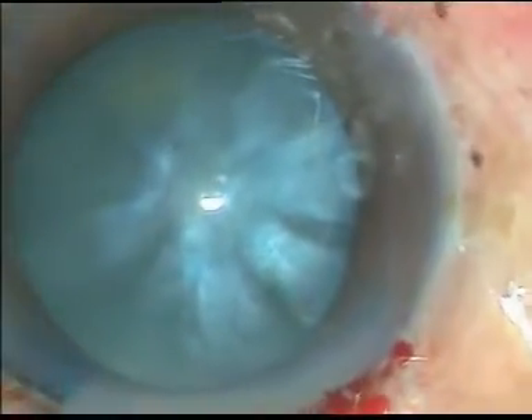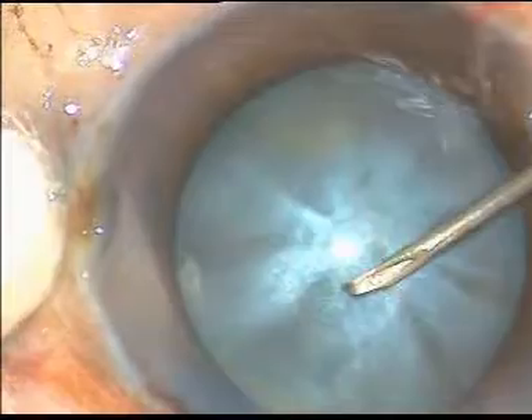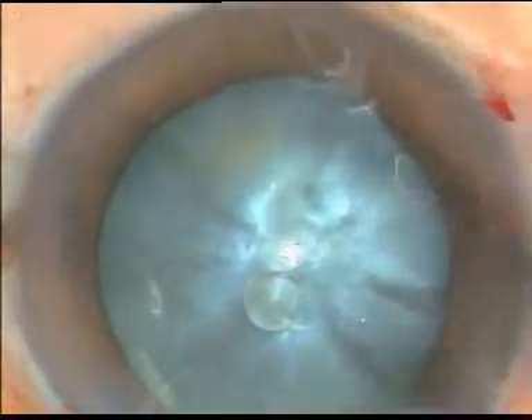Now I take a 26-gauge bent cystitome and give a small puncture — a small cut at the center of the anterior capsule.